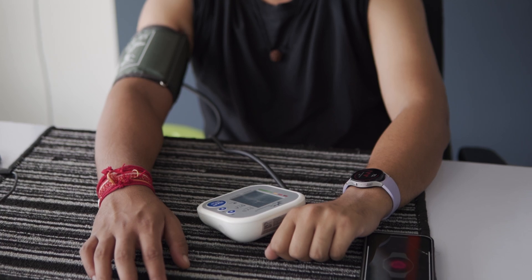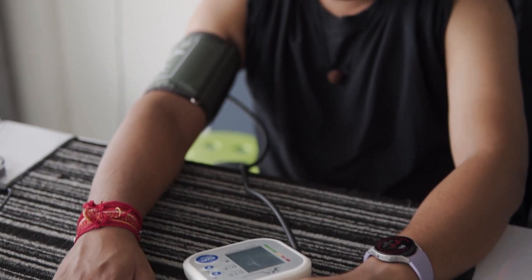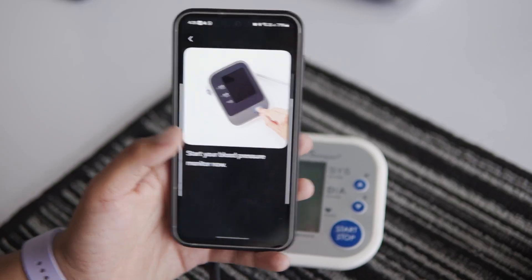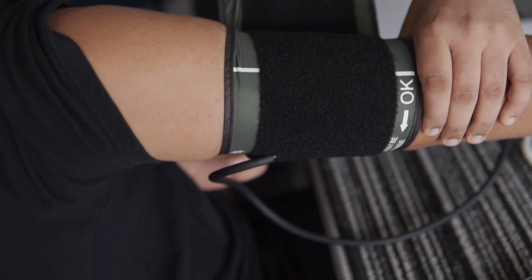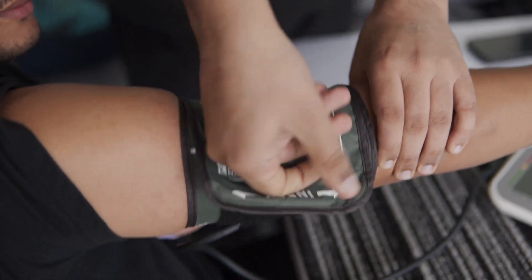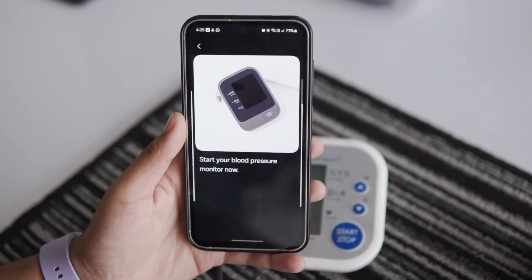Let's see how the Galaxy Watch 5 compares in accuracy to the professional monitor. To compare my blood pressure readings, first I need to calibrate the watch. I open the Samsung Health app and go to the blood pressure option. I need to fit the blood pressure cuff on the arm opposite to the one I'm wearing the watch on. After putting it on, I tap on next and the health app prompts me to start the blood pressure monitor.